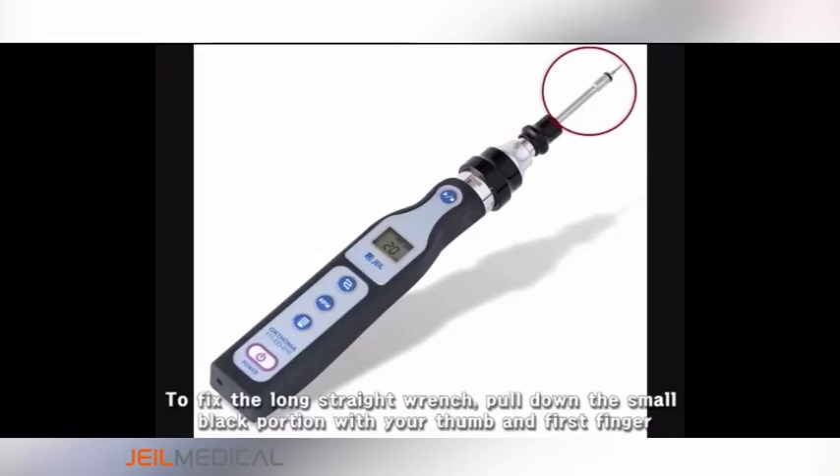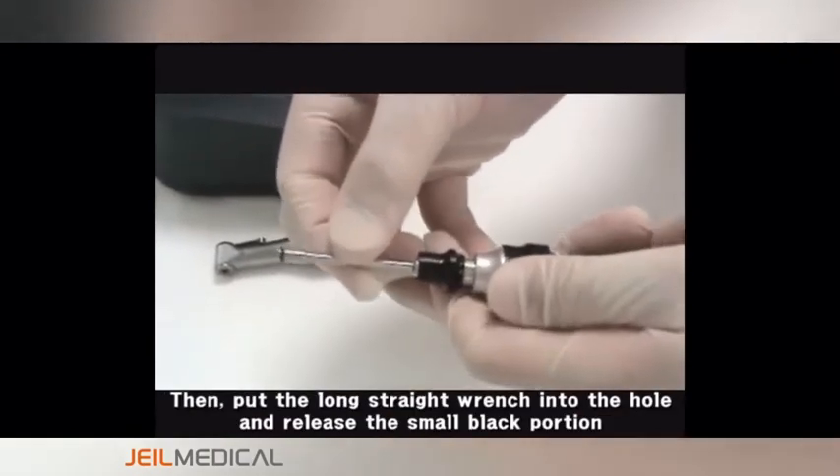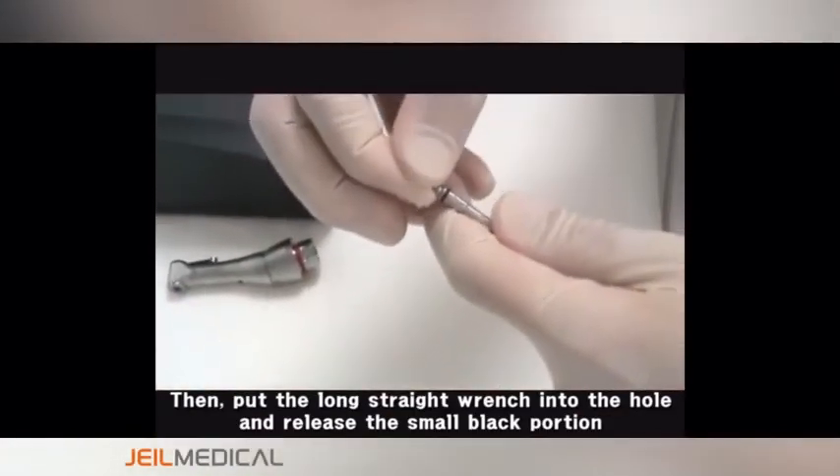To fix the long straight wrench, pull down the small black portion with your thumb and first finger. Then put the long straight wrench into the hole and release the small black portion.